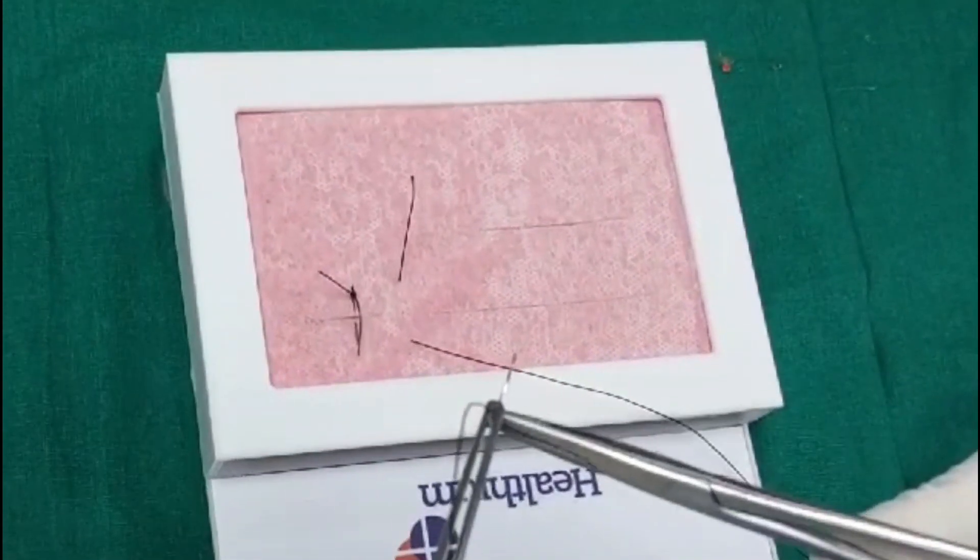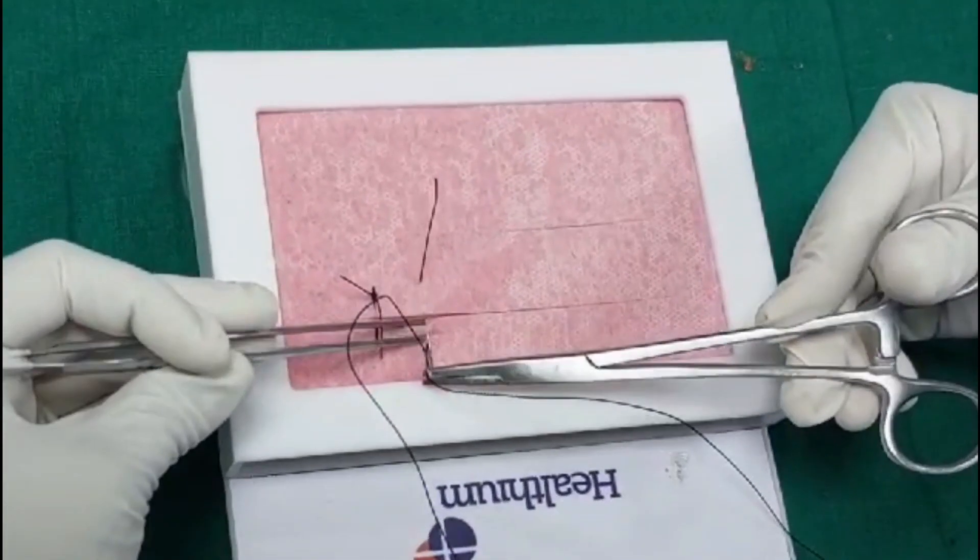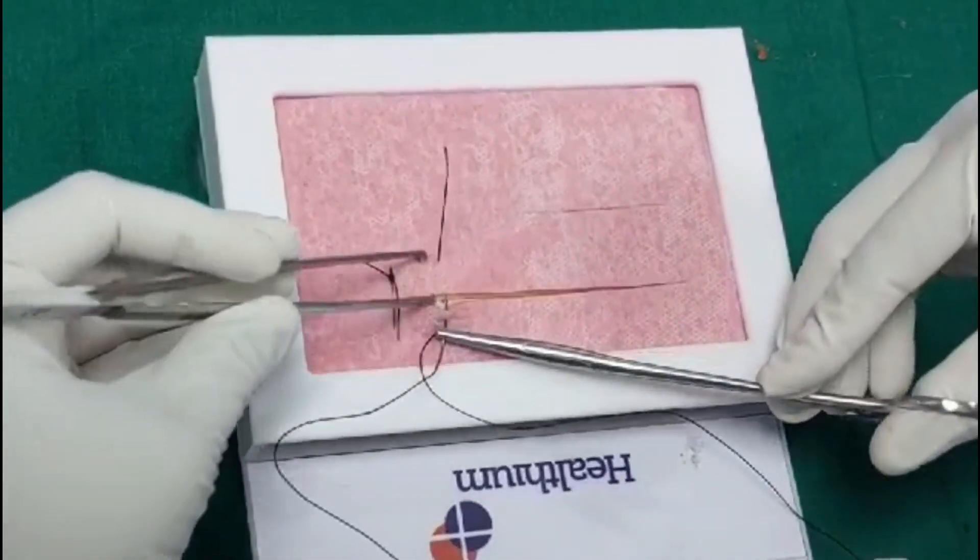These near-near bites are taken very close to the skin edges, taking as little of skin as possible.